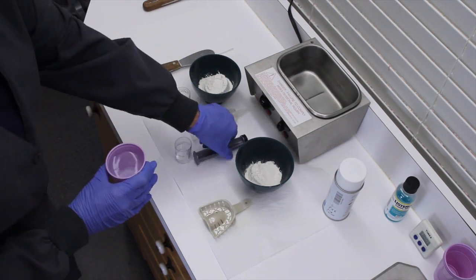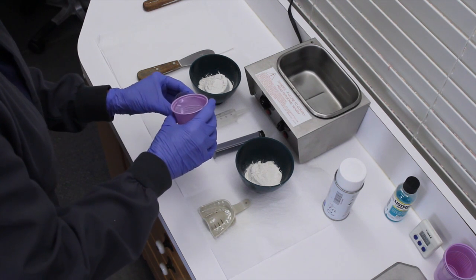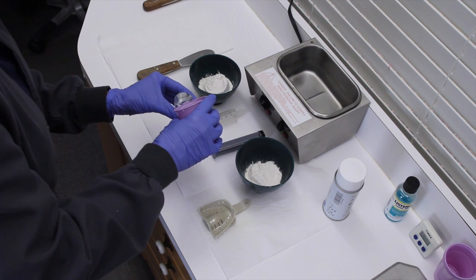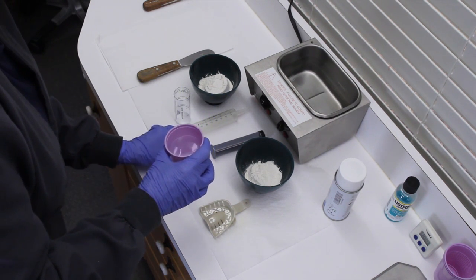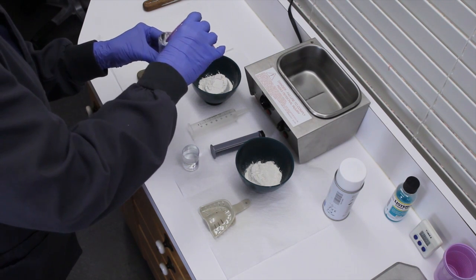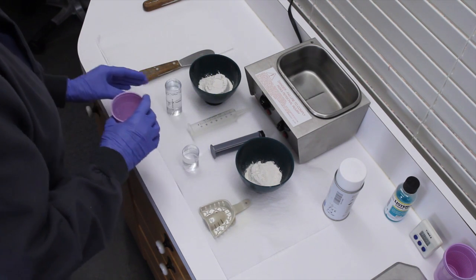And now Donna's going to use our little pre-measured cup so that we're going to have exactly the same amount of water each time and get our nice consistent mix. The smaller cup is actually for the low viscosity, and the large cup is for the high viscosity. With that done, she's going to go ahead and mix.